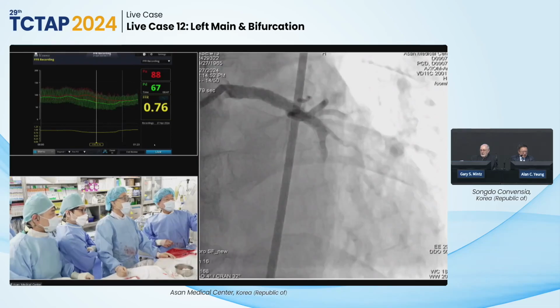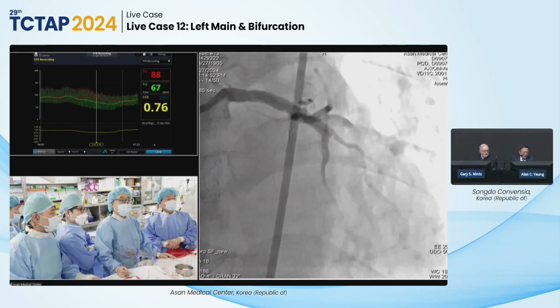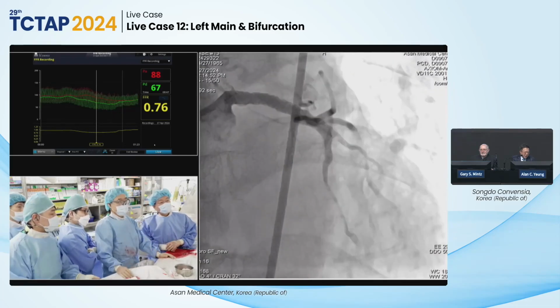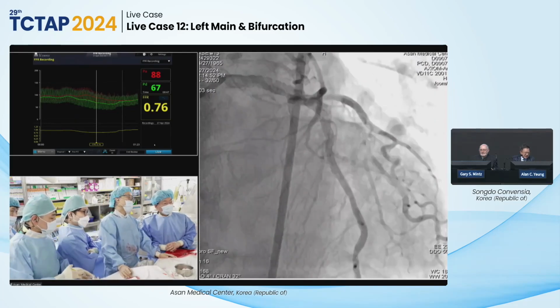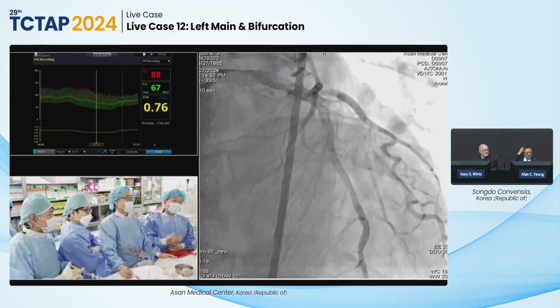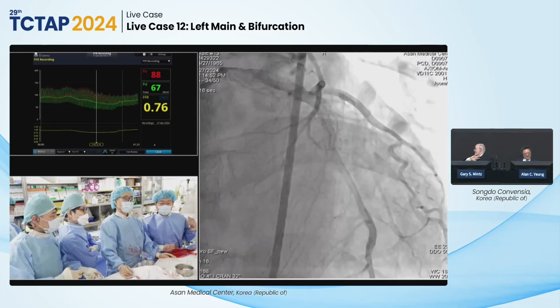So this is the last angiography picture? Yes. If you use angiographic guidance, most people would not have imaged the diagonal to start with, and of course would not have done FFR afterwards. If this patient were angiography-guided PCI, we would just treat and do final optimization, and most people would just leave the diagonal alone. They would say, look, this is moderate disease, and that's it. So even if angio-guided, you would still think about the small jeopardy area. That is clinical decision making, even with angiographic findings.